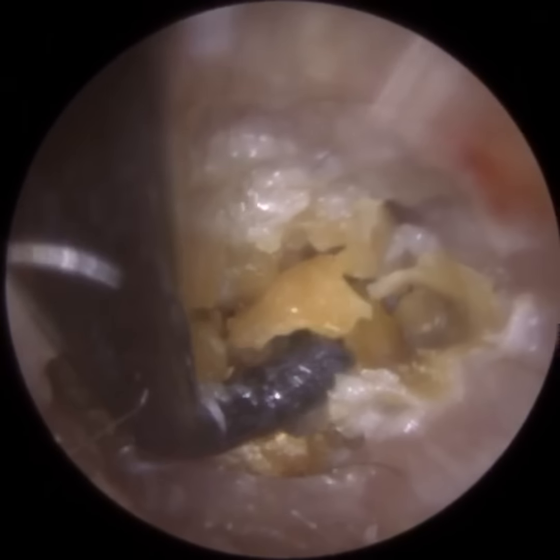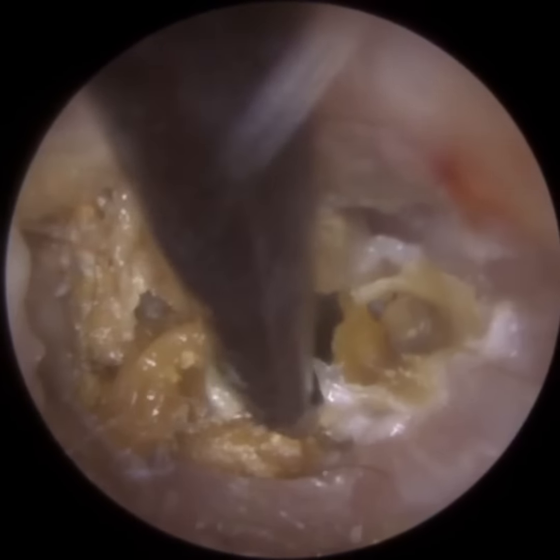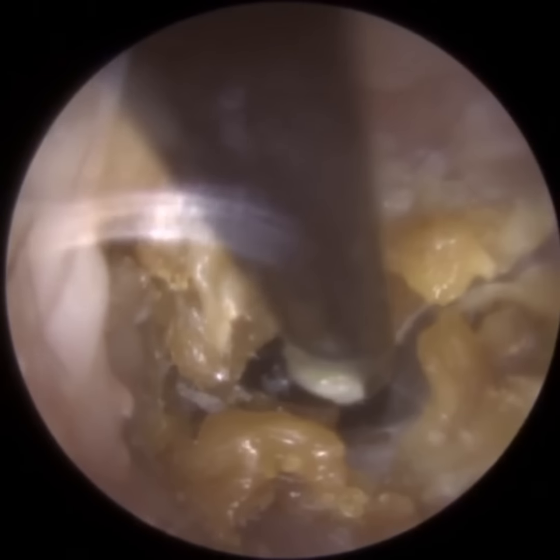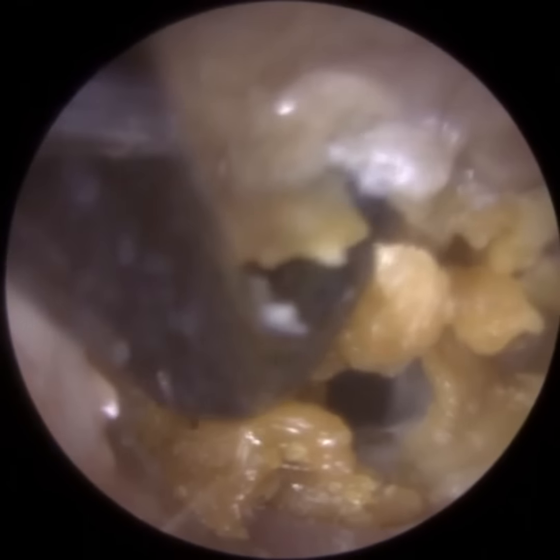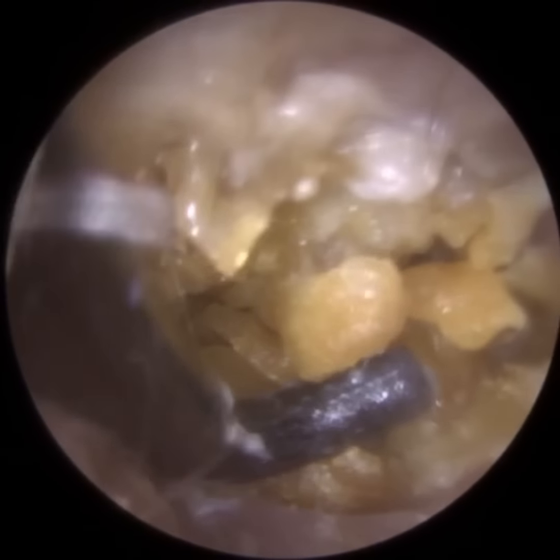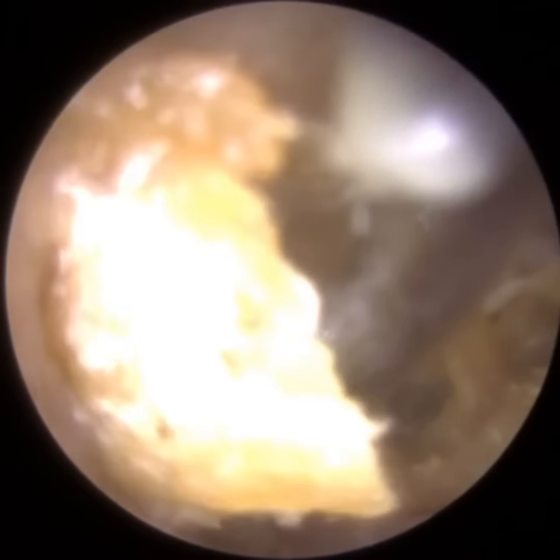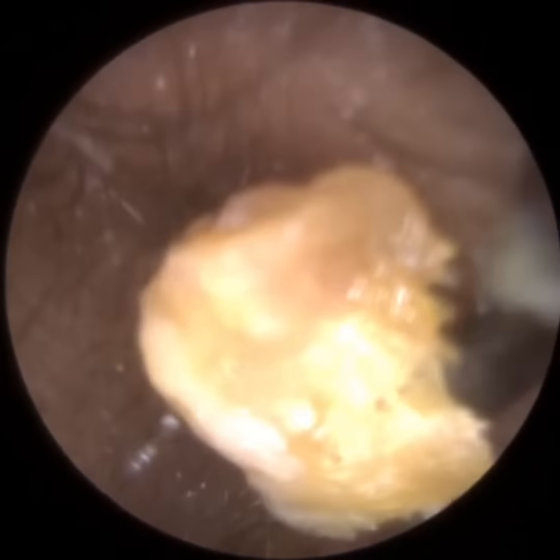So I've created a gap in the middle, so quite deep now, probably about half a centimetre to a centimetre away from the eardrum. Delicately inserted the tip of the hook into the gap. I'm just rotating it, just slowly loosening it off the canal, nice and gently. I managed to bring that one forward. There is some granulation tissue there as well.